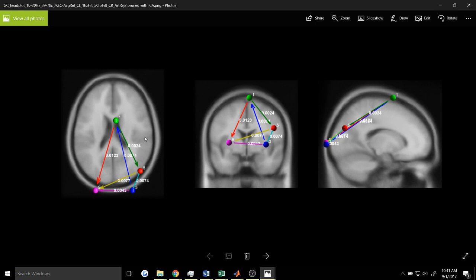That would be the net sum of causality between 1 and 5, combining that with the causality between 5 and 1. And depending on whether that's positive or negative, the direction of the arrow will represent which source has a greater causality on the other source.